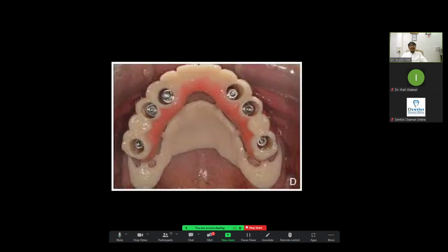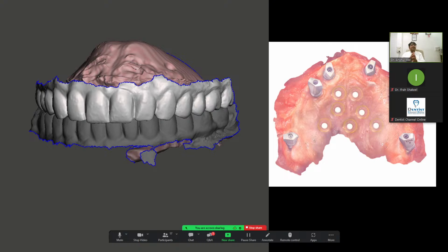The same way with freehand. In the freehand case your previous denture is ready. You pick up the impression with the abutment and then you can send it to the lab. Now the patient is happy for 3 months, there is no issue. Now you want the same midline and occlusal plane for your final or the delayed loading. So what you can do is, inside the prosthetic you mop the palate, place flowable composite, cure it, and scan it with the prosthetic.